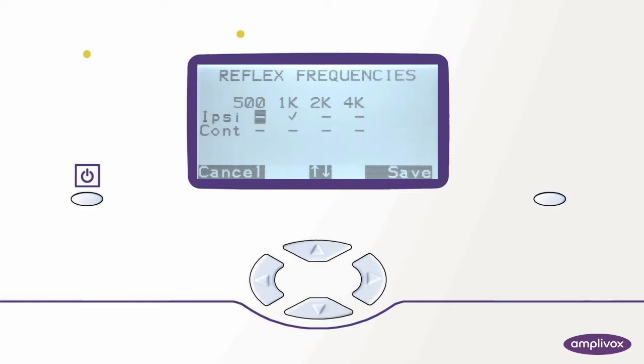In order to toggle through the different frequencies we select the down key and you will notice that every time we select that key we walk through the different frequencies. In order to activate 500 Hz for testing we select the up key and thereby change the line to a tick and the frequency is activated. We continue with 2 and then 4k. We save our changes with the right key.